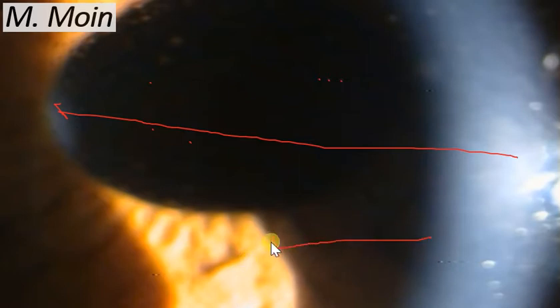The next thing which you want to see after KPs is cells. Sometimes capturing on video slit lamp is difficult, but these are cells in the anterior chamber. You shine the light from one side and make it shine on the surface of the iris. You are actually best able to see those cells in this dark area of the pupil, especially by the scatter of the light. You reduce the light to three millimeters and then make it finer or broader according to how much you need.